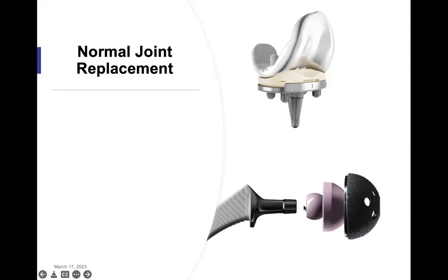At the bottom right-hand side of the picture is a total hip replacement implant. Here is the part that goes into the thigh bone. Then we have a pink ball that typically snaps onto it, made out of ceramic. Then you can have either a pink or a white structure that snaps into the metal socket. White is typically plastic and pink is typically ceramic. Ceramic on ceramic implants can typically have squeaking associated with them, whereas ceramic on plastic implants are largely quiet.